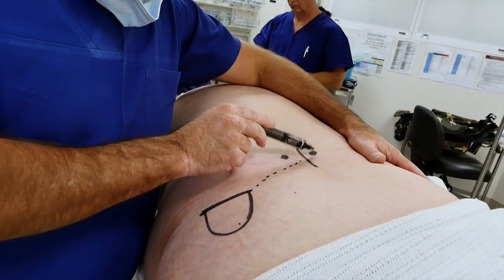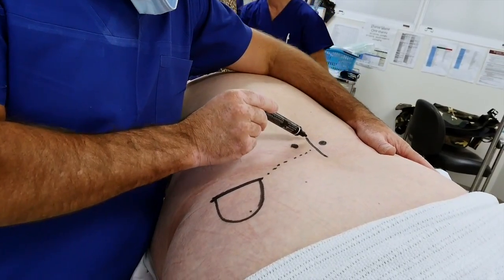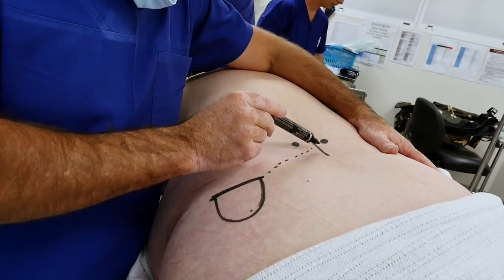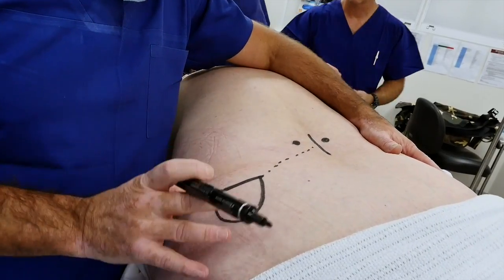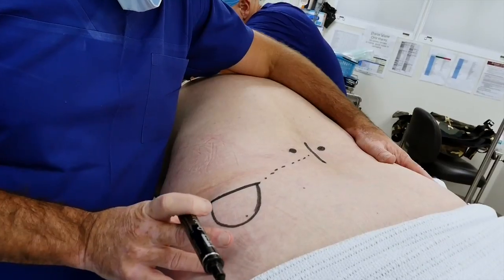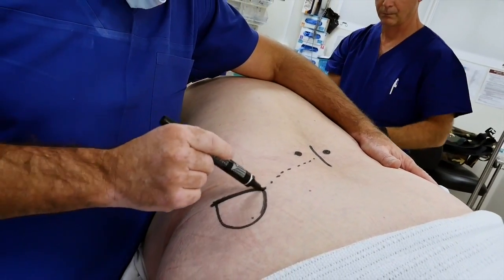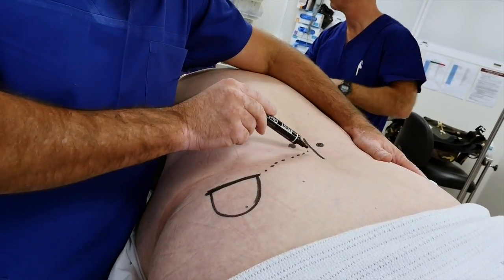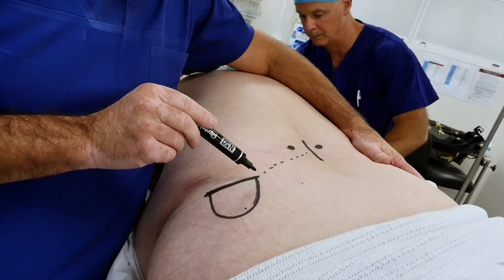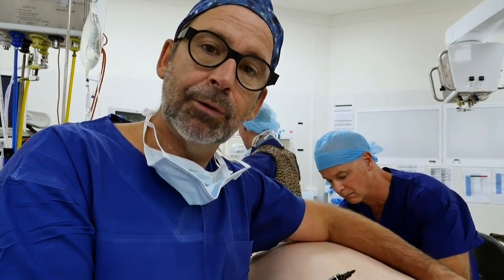In summary, I've marked where her sutures were. I've drawn a line that goes from about one third above to two thirds below, right centrally over the spinous processes. I've palpated the little upper outer fatty pocket in the buttock, checked it is below the waistline, and drawn a clean line where we're going to do our incisions. This is where the tunneling will happen between the two incision sites. Now we're going to finish getting scrubbed and prepped.